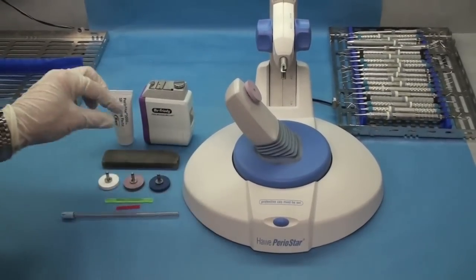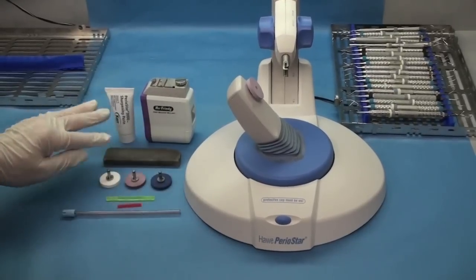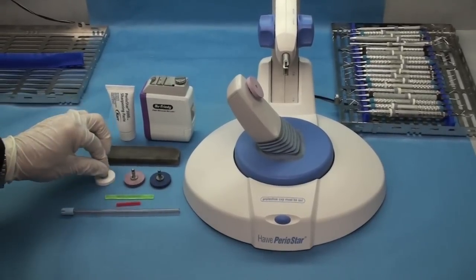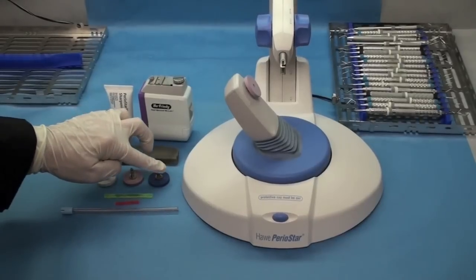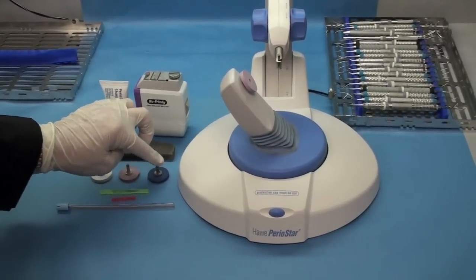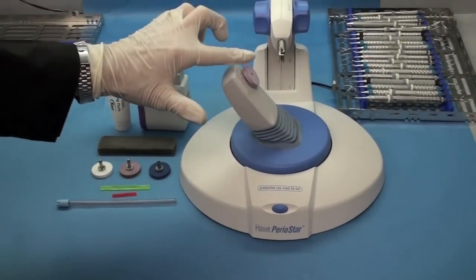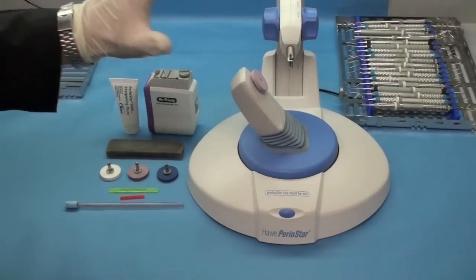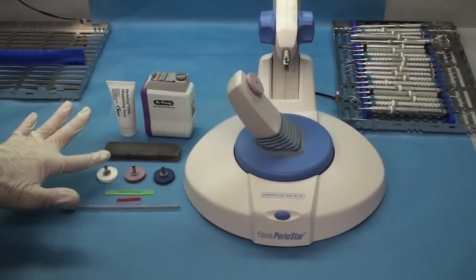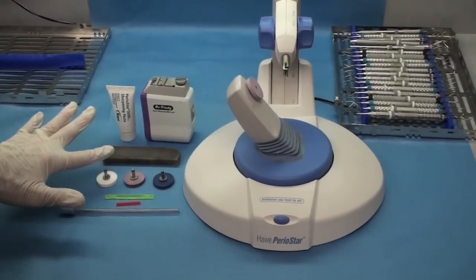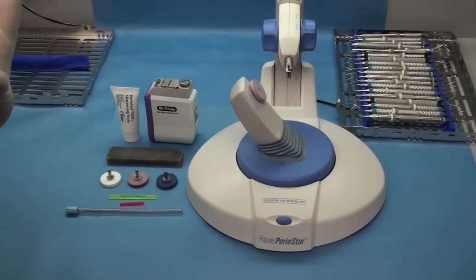With the Periostar comes three different sharpening stones. The white is fine, the pink is medium, and the blue is coarse. So your more dull instruments, you'll need to use the blue. We usually use the pink one that's kind of right in the middle. The white one, when you have brand new instruments, is a great one to use just to kind of touch them up a little bit.